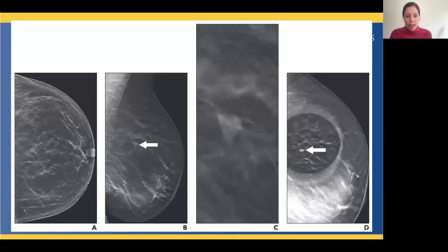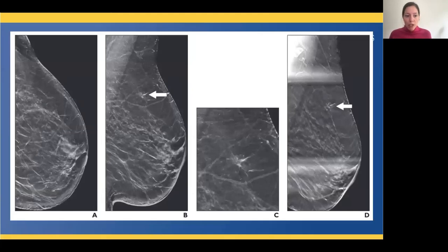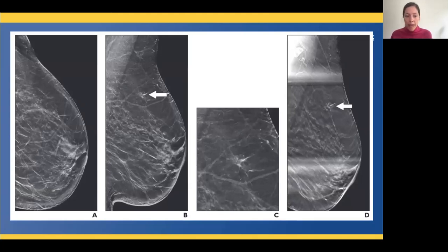Here are some examples of 1-view asymmetry. The first shows a left CC mammogram that was normal, and the second image shows an MLO view with an asymmetry in the upper breast indicated by the arrow. The third image is a zoomed-in view of that asymmetry, and the final view is a spot compression view showing the asymmetry persists. There was no sonographic correlate, so we performed a tomosynthesis-guided biopsy, which revealed a triple-positive invasive ductal carcinoma. A second example also had a normal left CC view but showed an asymmetry in the upper breast on the MLO view, which persisted on spot compression with no sonographic correlate; tomosynthesis-guided biopsy yielded benign breast tissue.